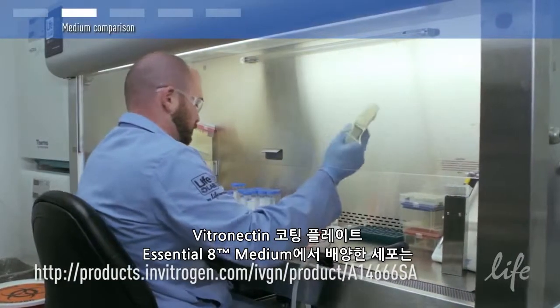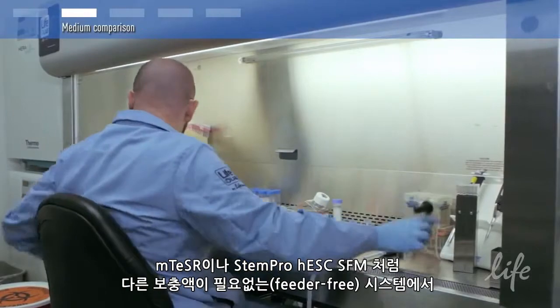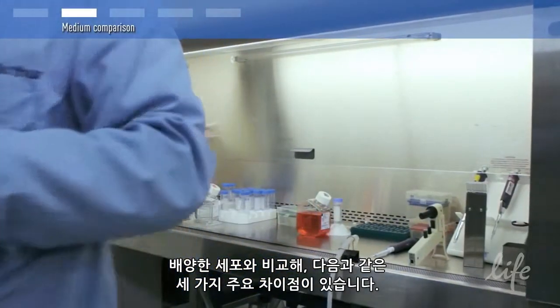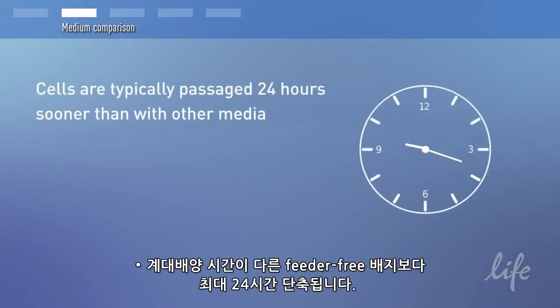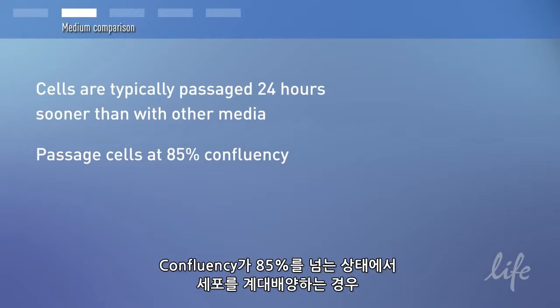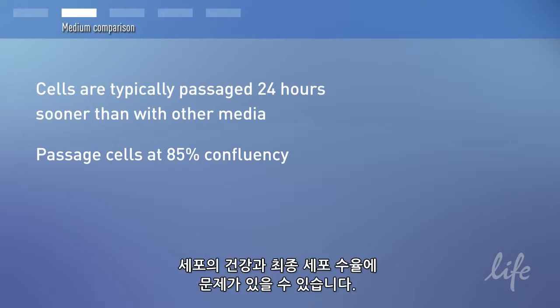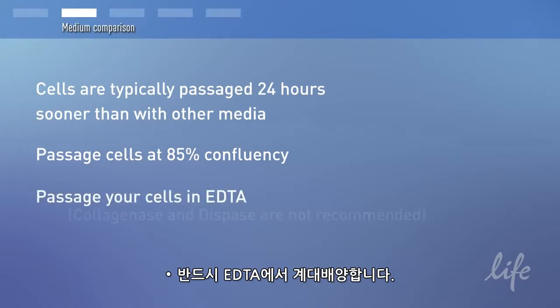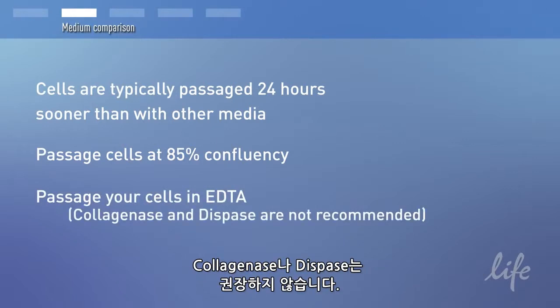There are three major differences that you'll observe with cells cultured in Essential 8 medium on vitronectin compared to other feeder-free systems such as mTeSR1 and StemPro hESC SFM. Cells are typically passaged 24 hours sooner than they would be with other feeder-free media. Passaging should take place when cells are at 85% confluency. If cells are passaged when they are more than 85% confluent, the health of the cells and the final cell yield may be compromised. Cells must be passaged in EDTA; collagenase and dispase are not recommended.